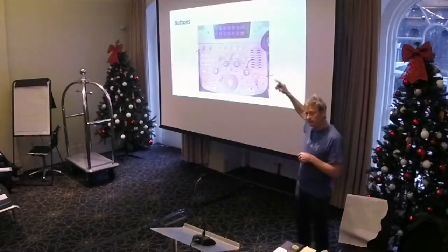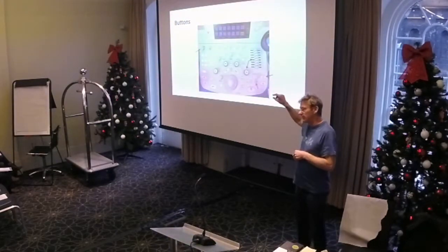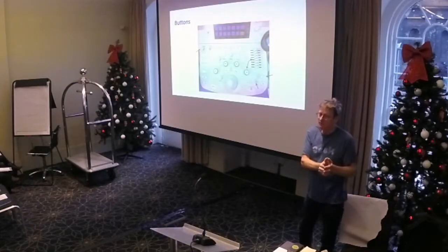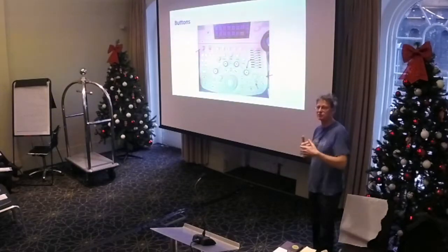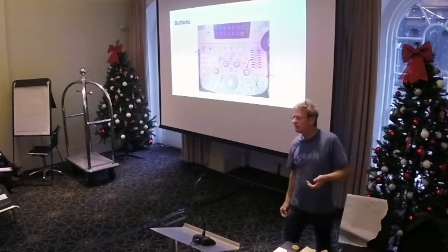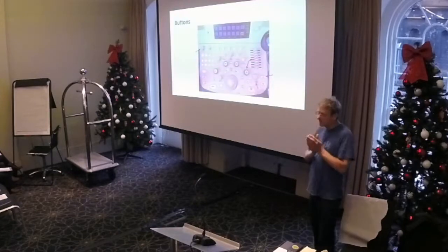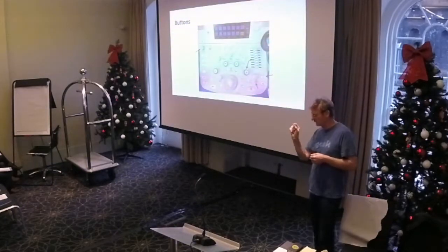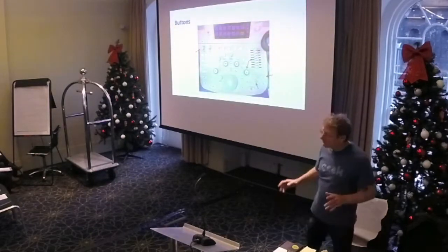And we also know that the non-disjunction rate, the abnormal mitotic rate, goes up with the higher the temperature. So on your screen on the ultrasound are things called mechanical index or thermal index, and that tells you how much damage you might be doing with your ultrasound waves. So you should always make sure that your power is at the lowest setting that produces a good quality image, just in case. Because they use ultrasound in physiotherapy to make people feel better, so it's going to have an effect. And particularly when you look at high power situations like colour Doppler, don't put them on little tiny embryos to see if there's a heartbeat. You could be frying this little baby. So be aware of power.